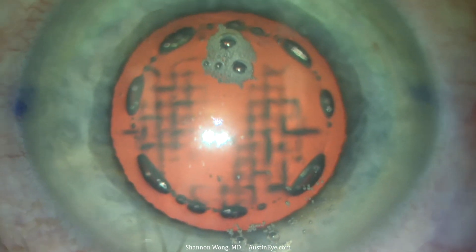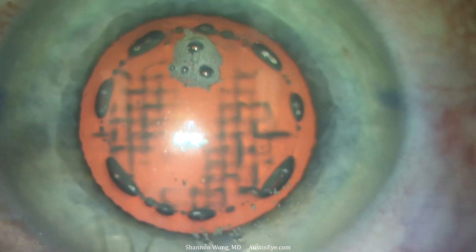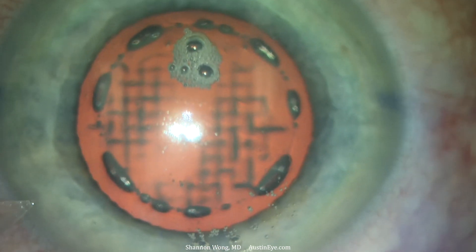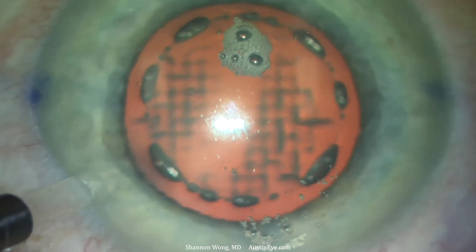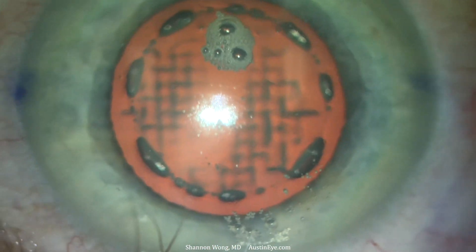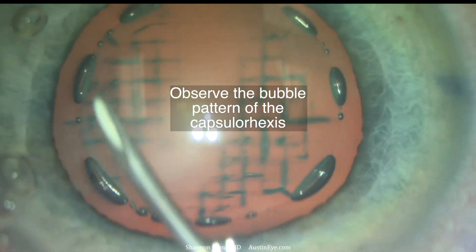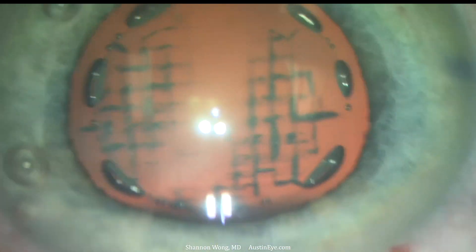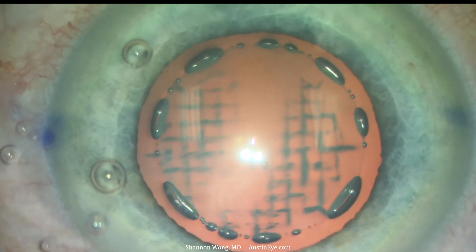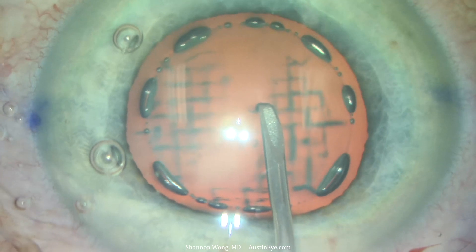On the case prior to this one, I found that the capsulotomy was incomplete and tried to use a cystotome and capsulorexis forceps to merge a manual capsulorexis in a connect-the-dots fashion with the femtosecond laser-created capsulorexis. That case ended up with an anterior capsule extension, which is less than desirable.